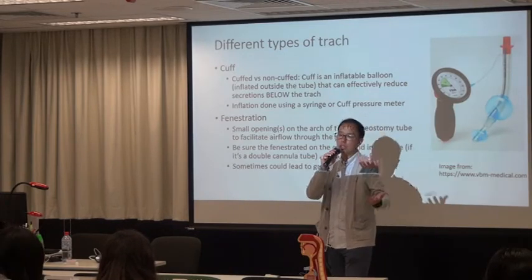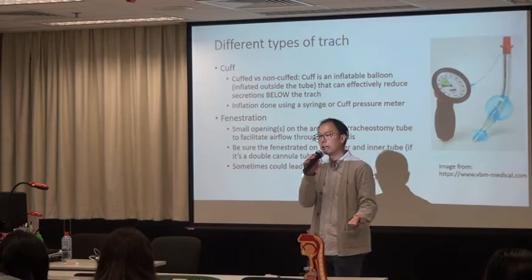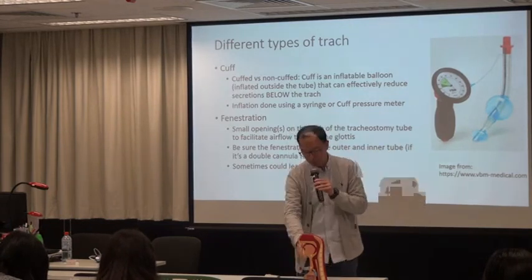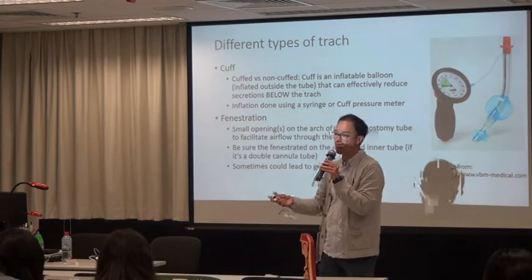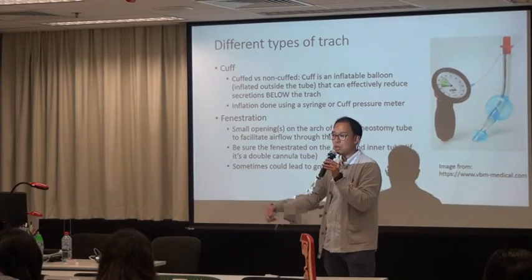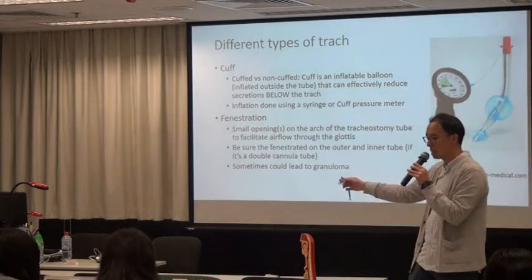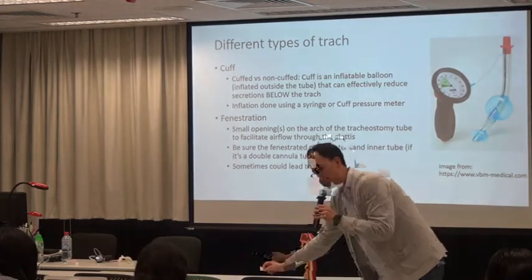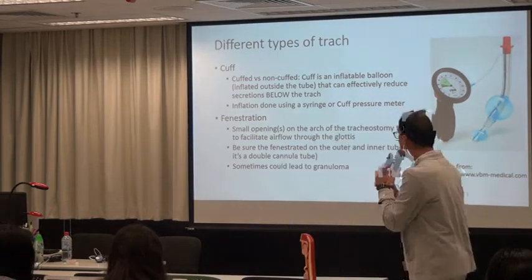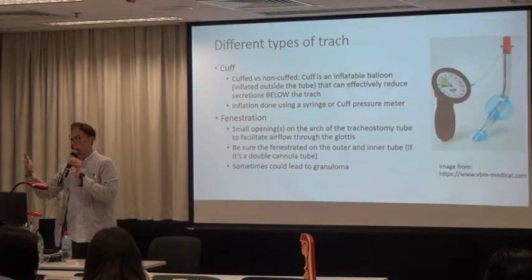that you're not injecting too much air or you're not injecting more air than how it was. Okay, and you're not injecting too little. Okay, but I would always advocate if you're gonna see a lot of patients with the cuffed tracheostomy, just bring along the cuff manometer. 貴你千零蚊嘅啫。OK，好，我寫埋 screen 出嚟啦。OK，好，so that's the cuff.